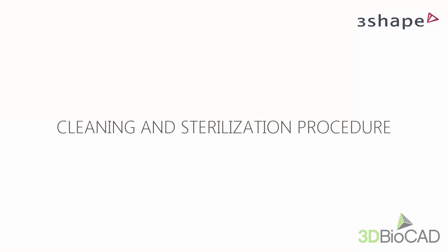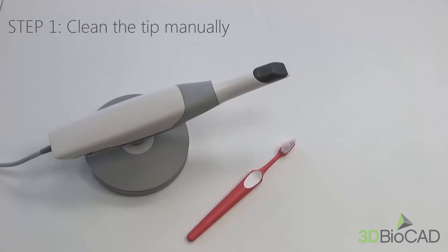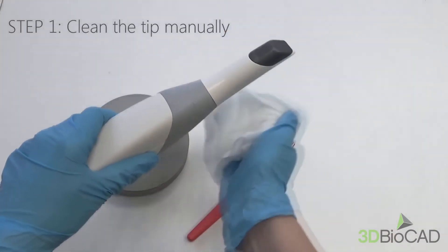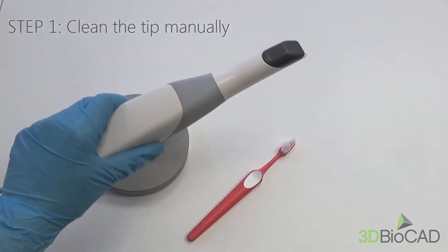After the scanning procedure, the tip must be cleaned and sterilized before it is used on the next patient. This is to avoid cross-contamination. As a first step, clean it manually using soap and water and, if necessary, a brush or cleaning tissues.